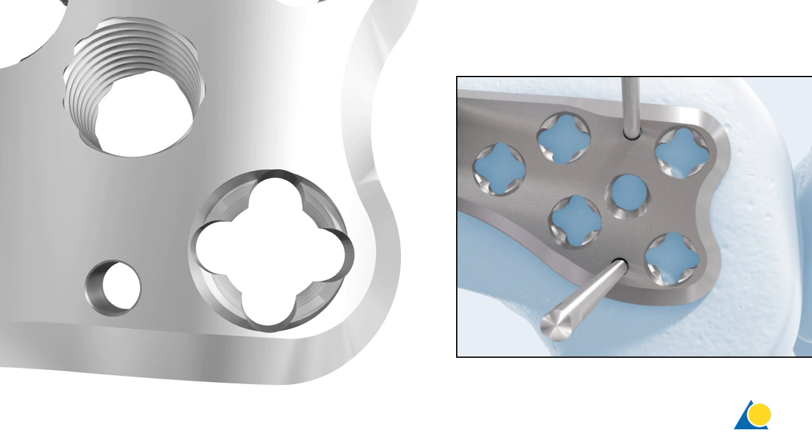4 columns of threads in the variable angle locking hole provide 4 points of threaded locking between the variable angle LCP plate and the variable angle locking screw, forming a fixed angle construct at the desired screw angle.